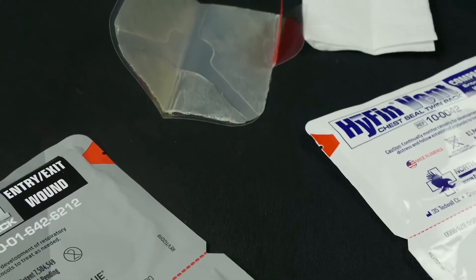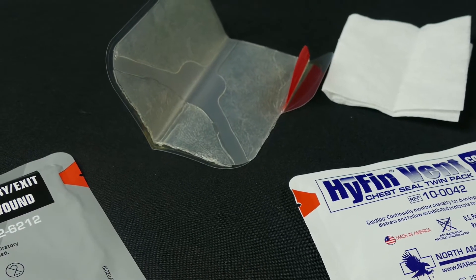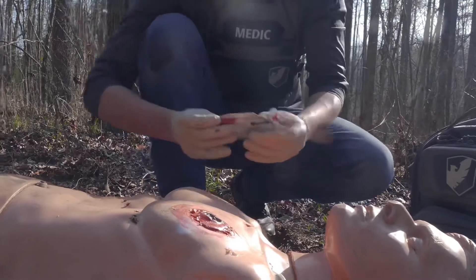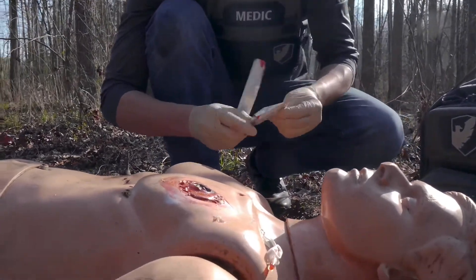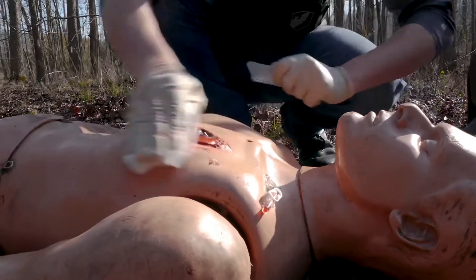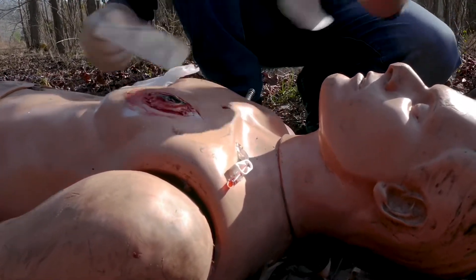This can be a piece of plastic or preferably a commercial chest seal. These commercial chest seals are great and you can get them vented and non-vented — definitely prefer the vented. That way it allows any air trapped inside the chest wall to move out, but doesn't allow that air to go back in. Once you have your occlusive dressing, go ahead and apply it directly on top of the sucking chest wound or the penetrating trauma.